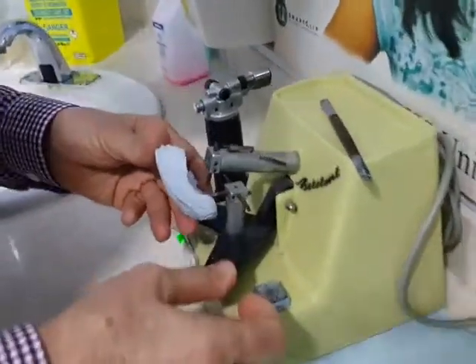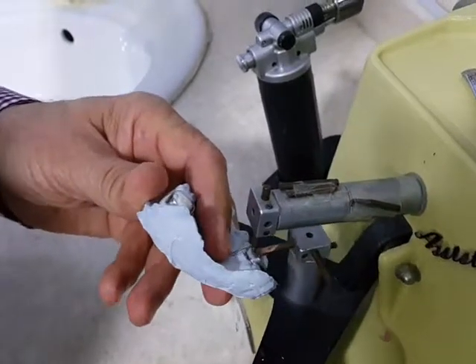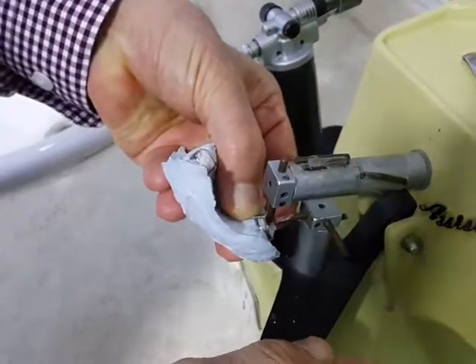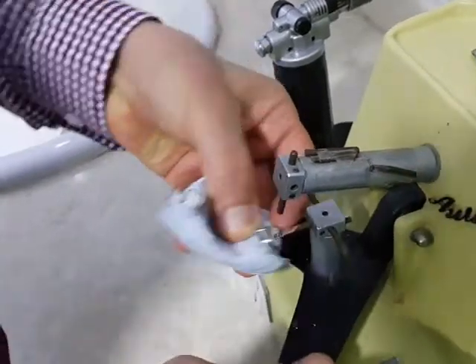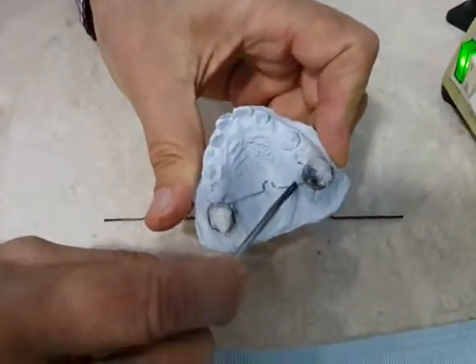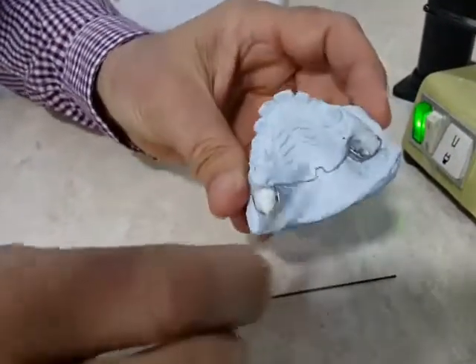Using the welder now. This welding procedure gives exact positioning of the band and the arch wire.